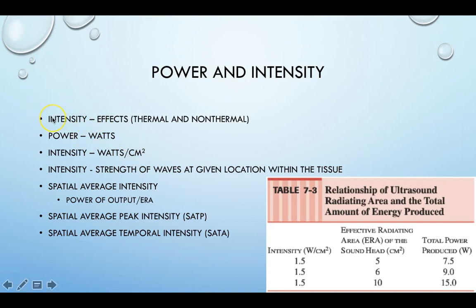So when we set frequency, we were setting our depth, our target depth. When we set intensity, we set the effects that we want, so whether we want thermal or non-thermal effects. Now, every time we use ultrasound, we get both of those things, thermal and non-thermal effects.